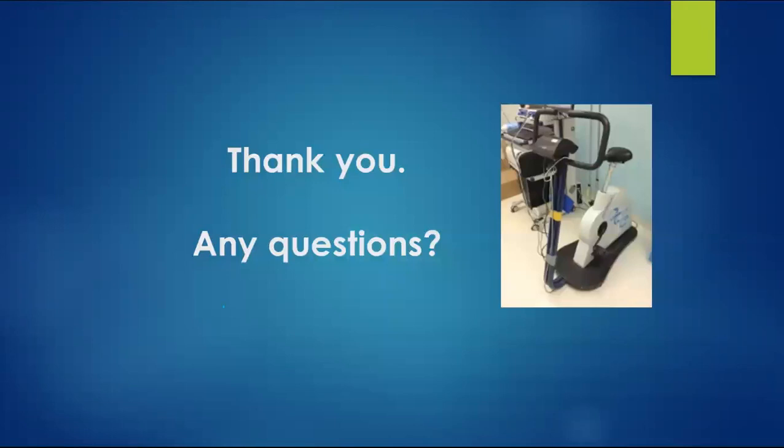I think Cpet's great for us. You talk some numbers, and we find that very reassuring. I'm not sure in a world of joint decision making in the perioperative period how much it helps the patient with their decision making process, especially the high risk patients. If you're already going to say to someone, "I'm concerned that you might die in the perioperative period," and that patient still wants to go ahead with the surgery, unless you are going to use these cut-off points as a complete black and white yes, no, we can't really do that in today's society, then I don't see what value it has, especially at 500 quid a pop.